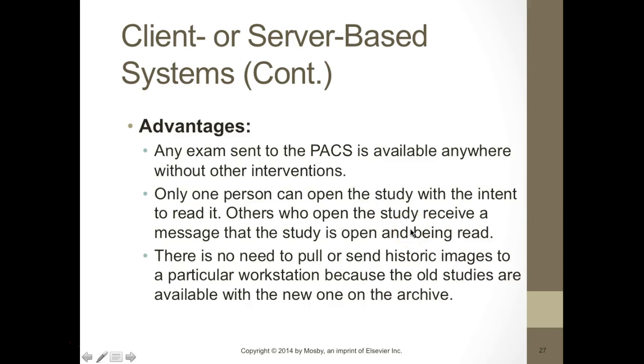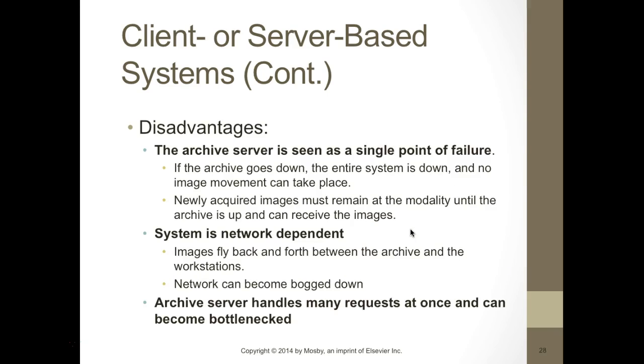So the advantages of the client or server-based systems is any exam sent to the PACS is available anywhere without other interventions. Only one person can open a study with the intent to read it. Others who open the study receive a message that the study is open and being read. So it tells you that someone else is in it. There is no need to pull or send historical images to a particular workstation because the old studies are available with the new one on the archive.